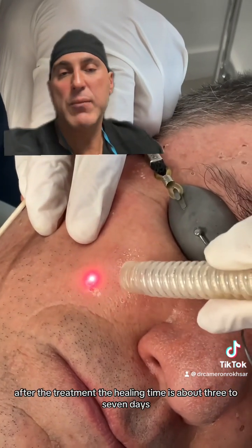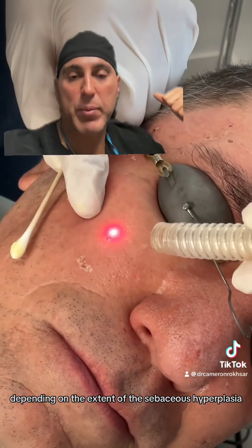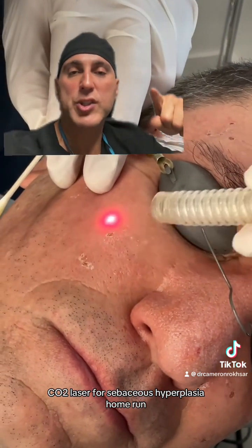After the treatment, the healing time is about three to seven days depending on the extent of the sebaceous hyperplasia. CO2 laser for sebaceous hyperplasia — home run.